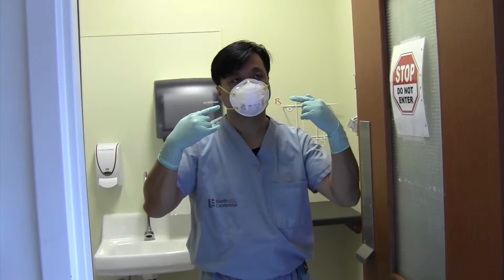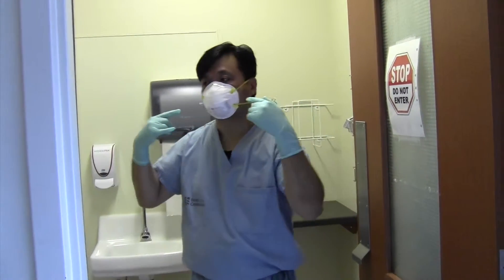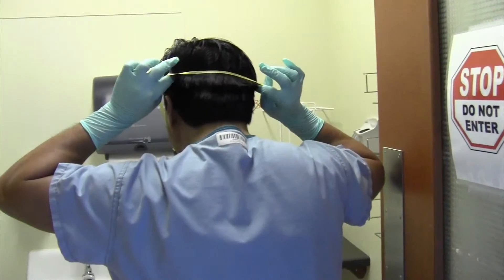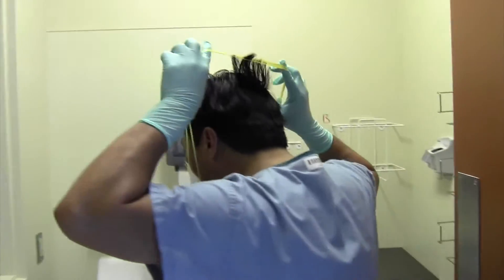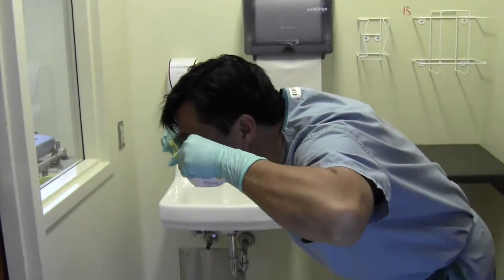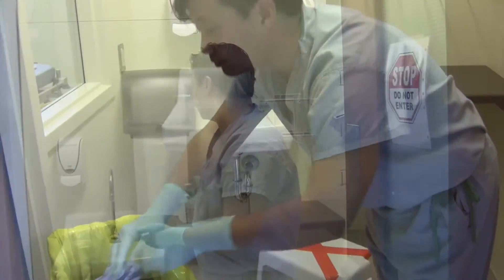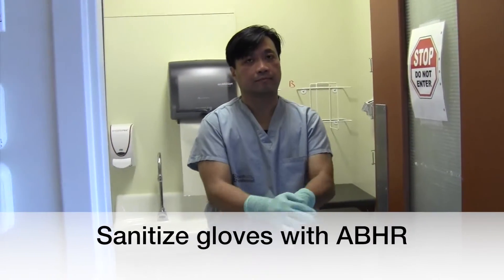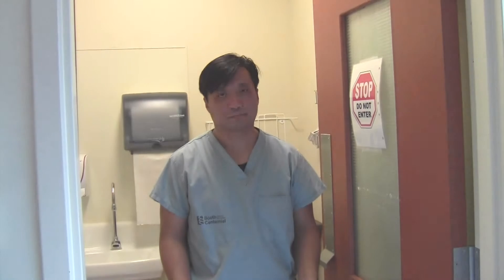Alternatively, you can remove your N95 respirator using a two-strap method where you grasp the bottom strap first, then pull the top strap at the same time using the same controlled motion to remove the respirator. Sanitize gloves with alcohol-based hand rub. It is important to practice with your own fit-tested N95 respirator to see which method works best for you.